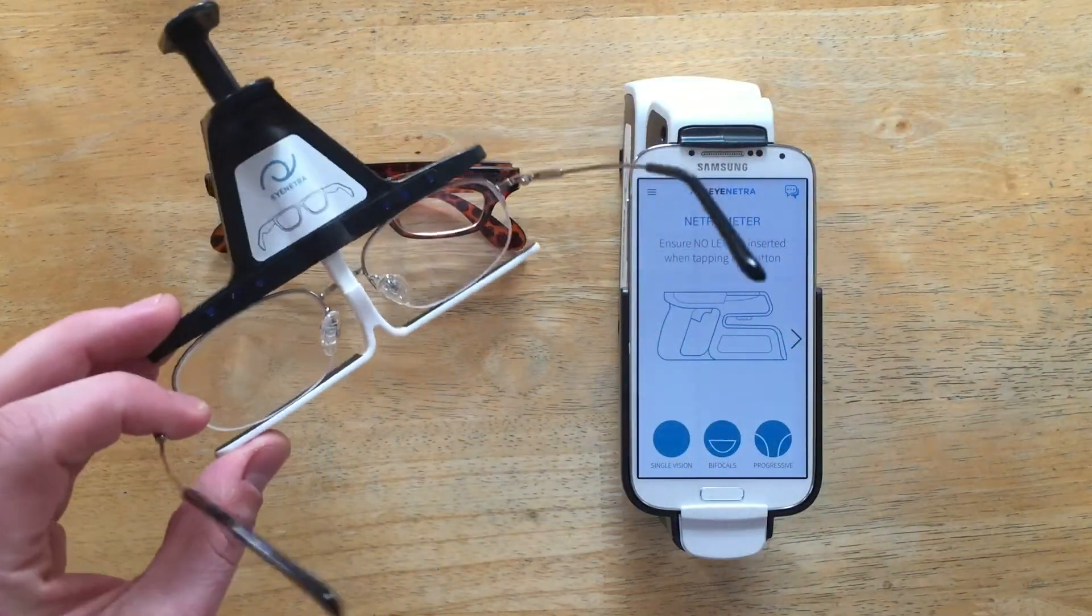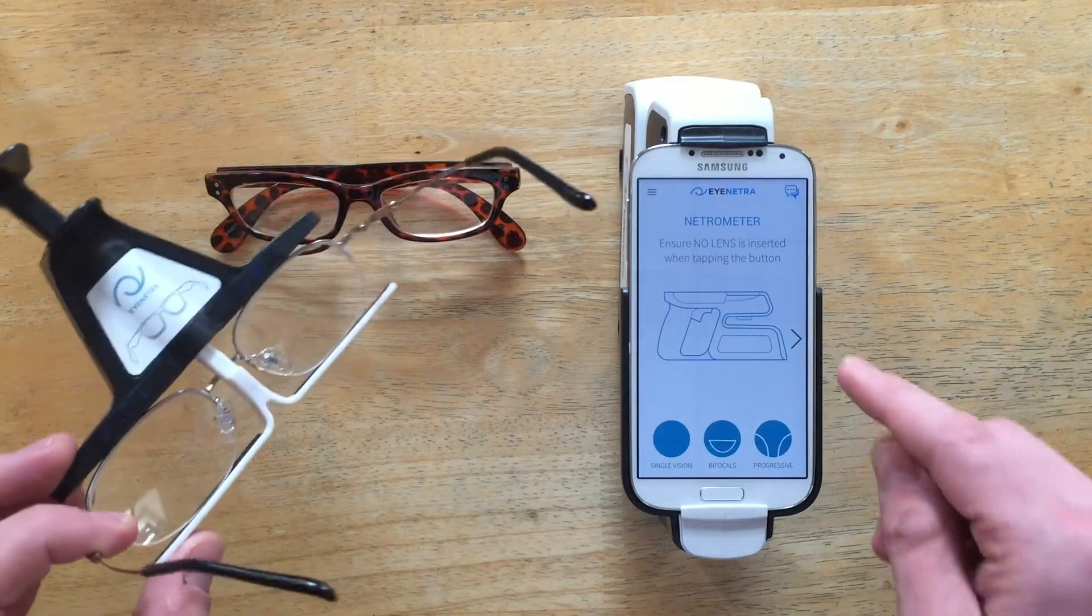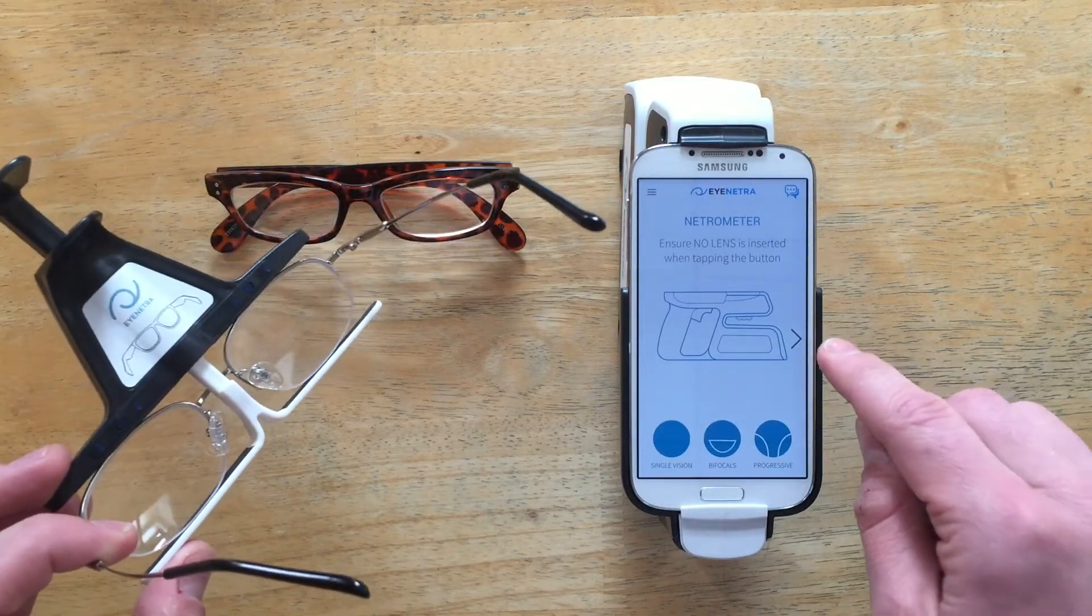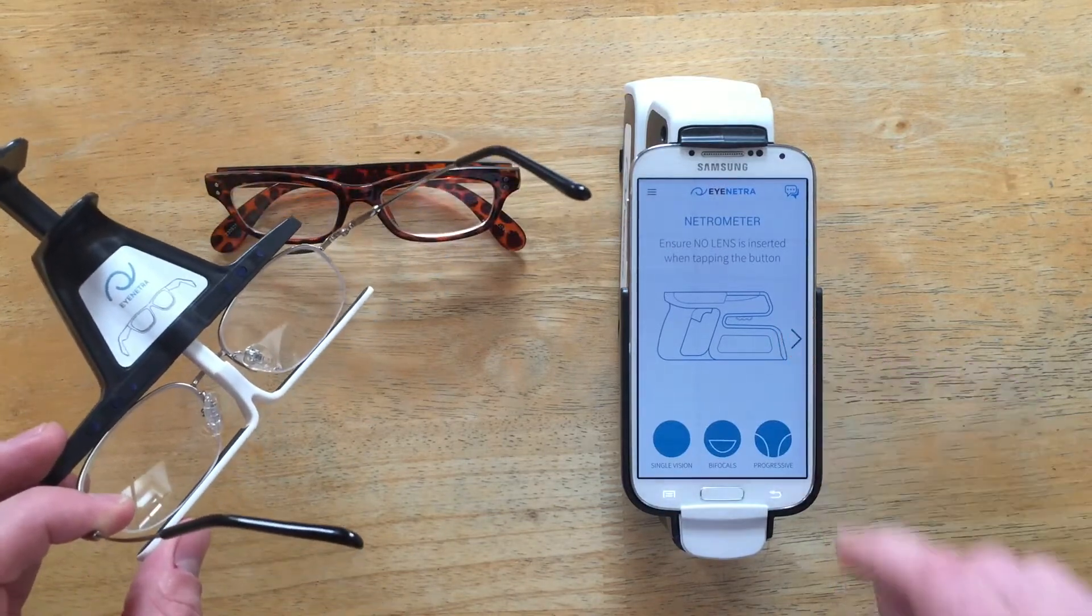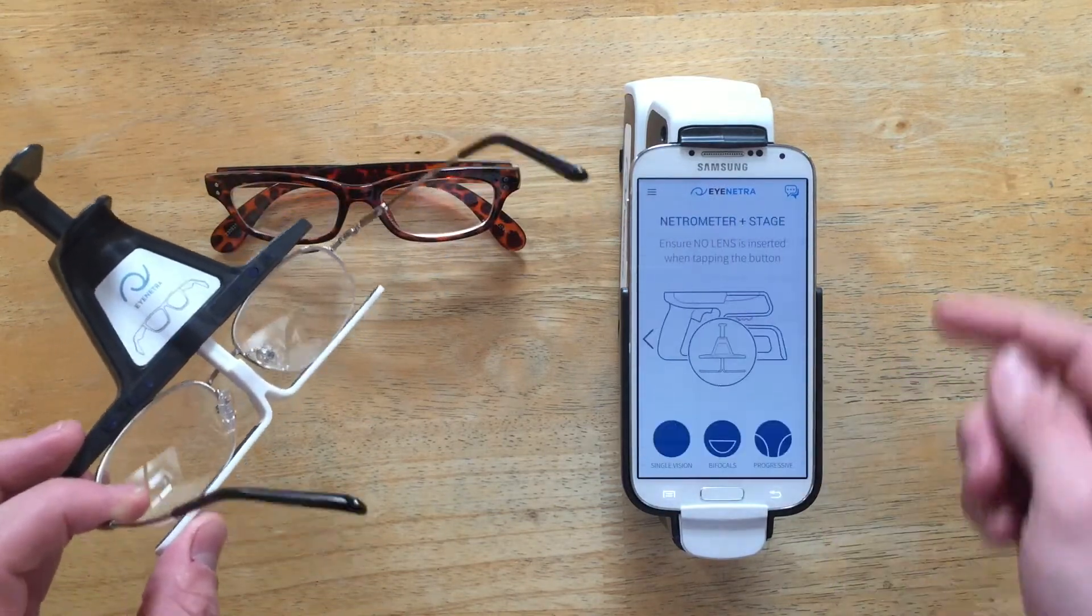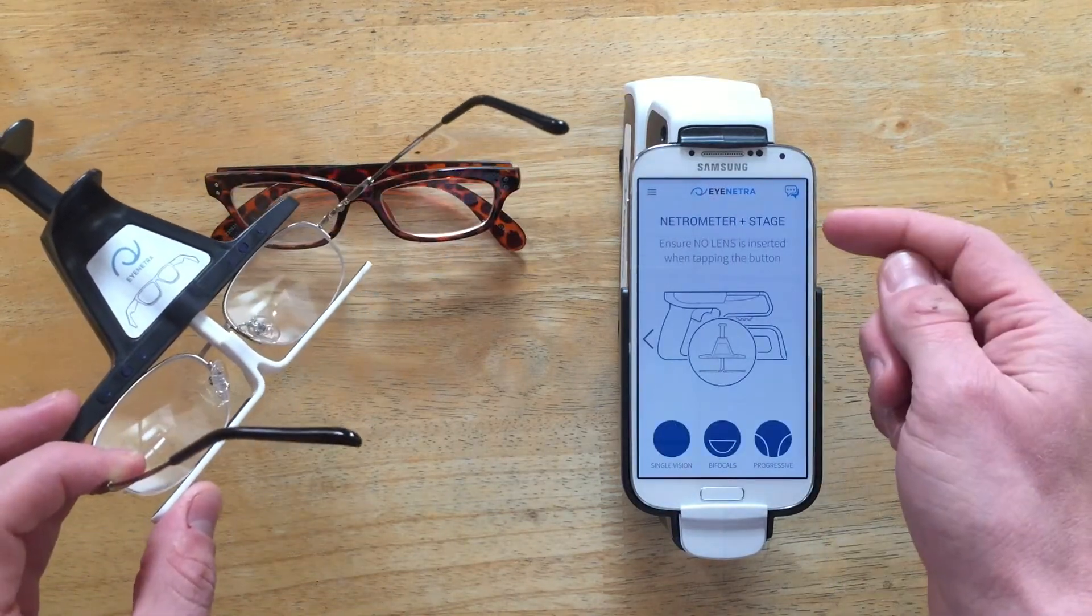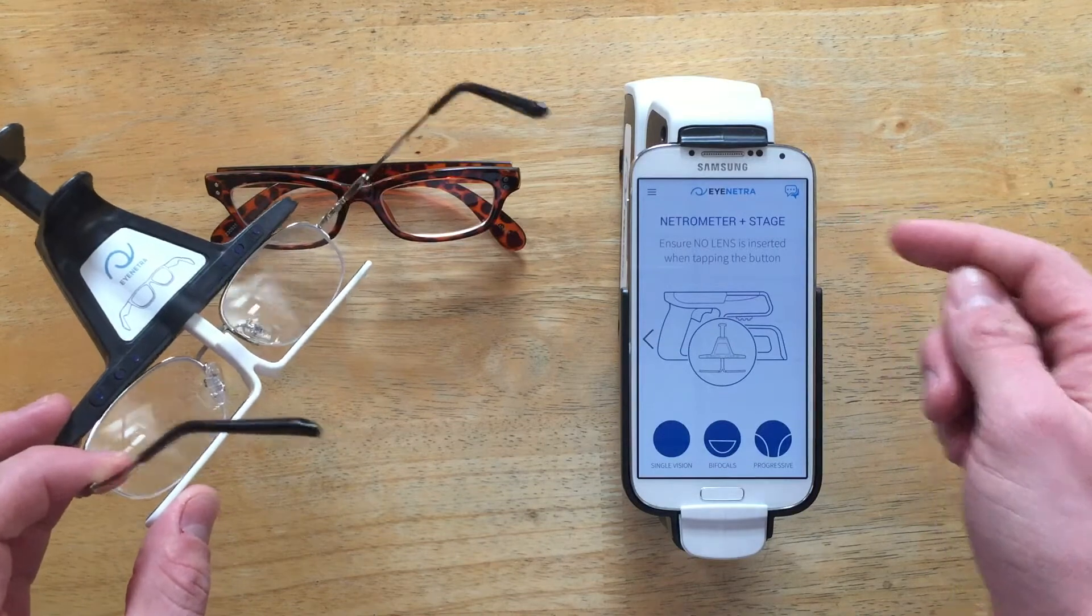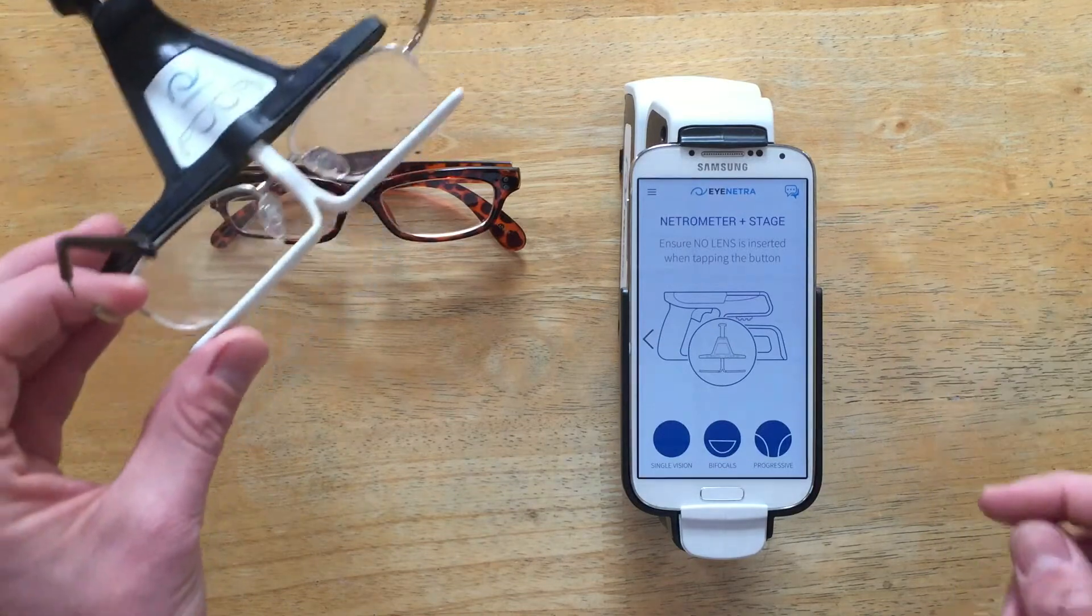When using the Smart Stage you want to make sure that you're operating in Smart Stage mode by tapping on this arrow here. You'll notice now it says Netrometer plus Stage.